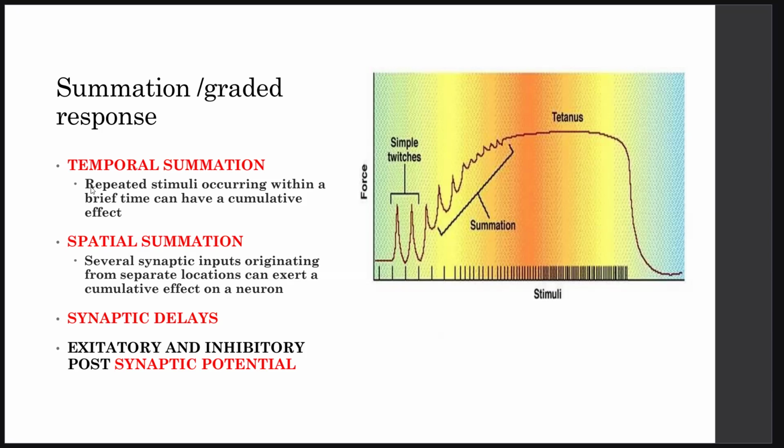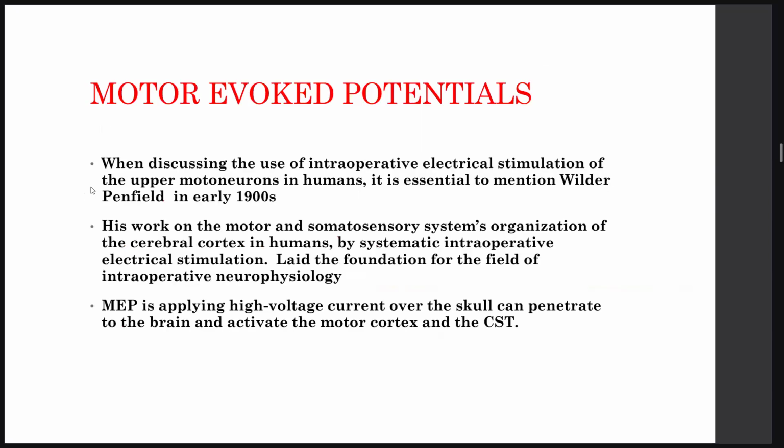When the excitatory potentials accumulate, and they are graded, also a graded response, fortunately, when they reach the level of the threshold and cross it, the action potential will be generated. So these properties act both well and not so well on the response that you are going to record and interpret in the theater.